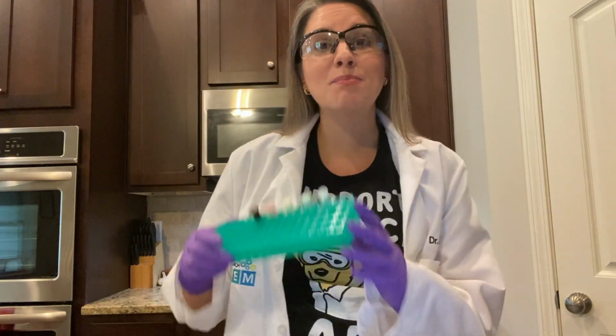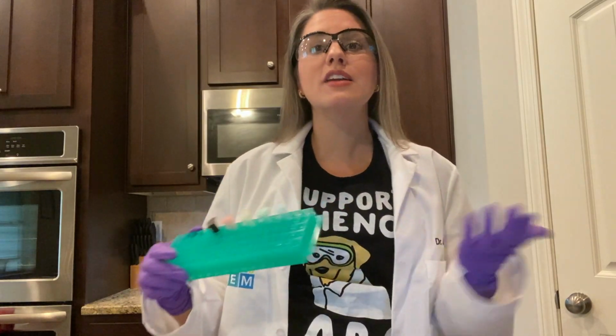Dr. Johnson here, and as promised, today we're going to explore the science behind antibody testing by running an actual test. I've got some patient samples here on hand, and we want to determine if they've been infected by the coronavirus. We can do that by looking for specific antibodies in their blood. Remember from our last video, antibodies are those Y-shaped proteins that our bodies make in response to infections caused by pathogens like the coronavirus. So how does it work?